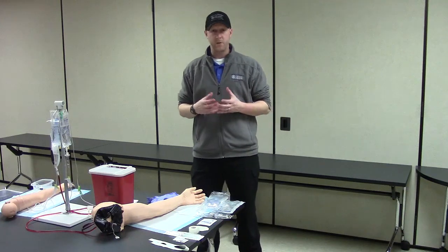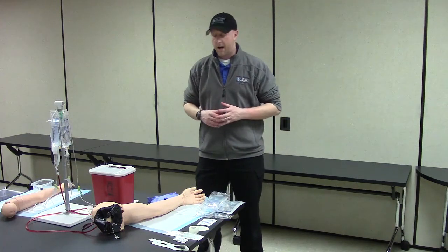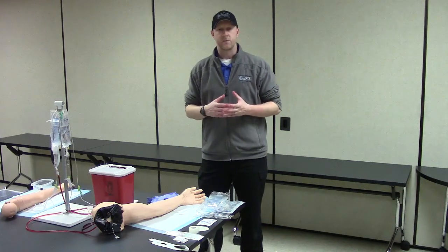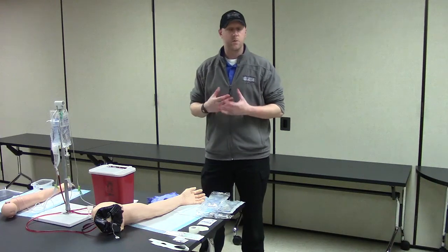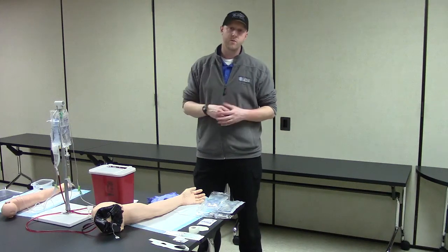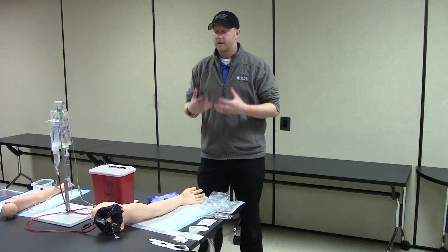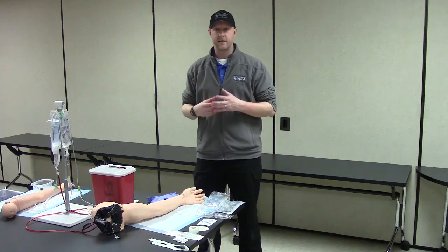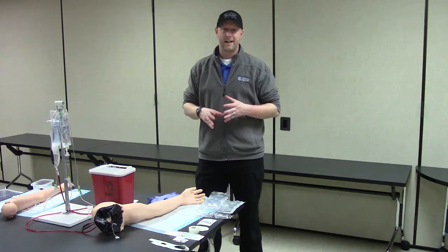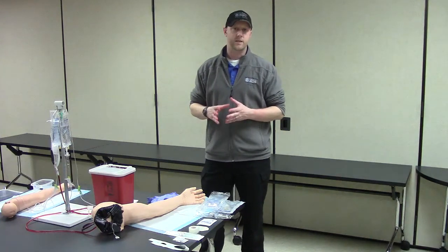As you look at this sheet, there are a few things we're going to do a little differently. When we're starting our IVs here, you're going to see me starting what we call a saline lock. Once we have a saline lock in place, it's easy to attach or remove fluids for our patients. We're beginning to start saline locks on basically all patients in the ambulance or in the ER, so we can easily connect or disconnect fluids.